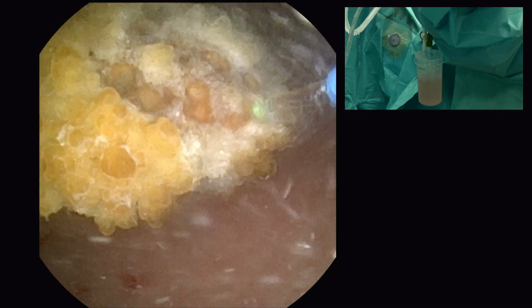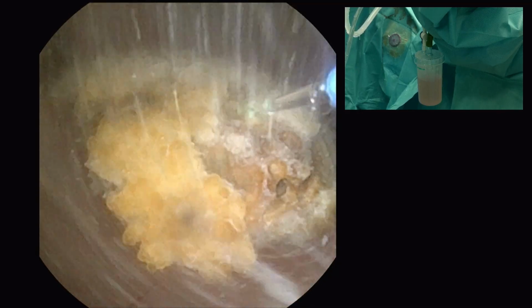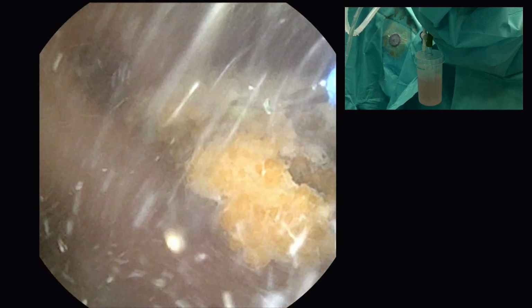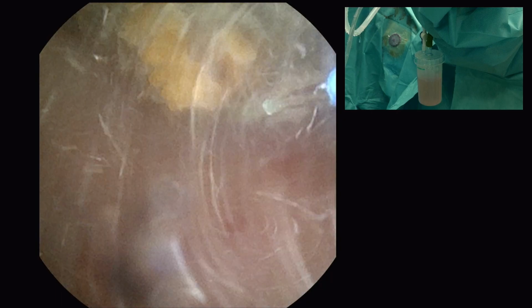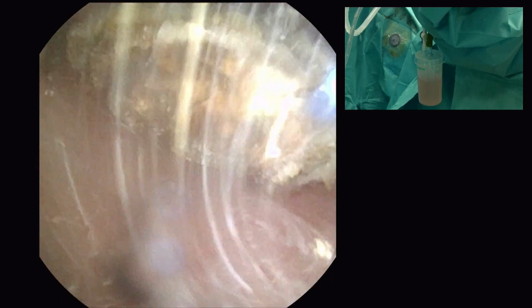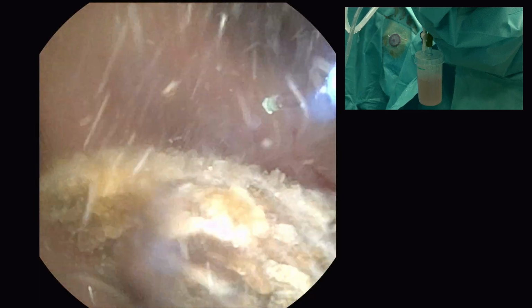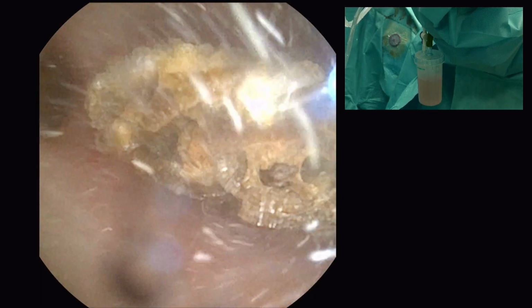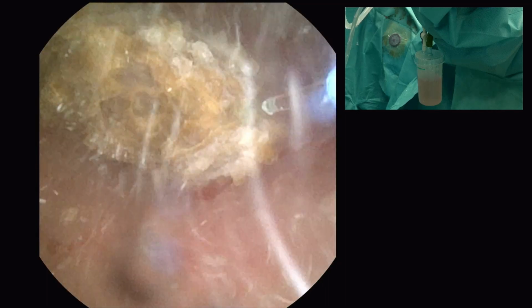You can see there is a hard core here. The first one, the anterior surface, was slightly softer. Now here, this is a hard one. No, it's enough. 42. It's enough.